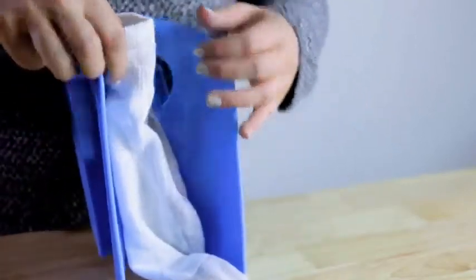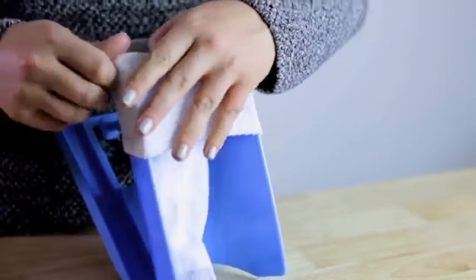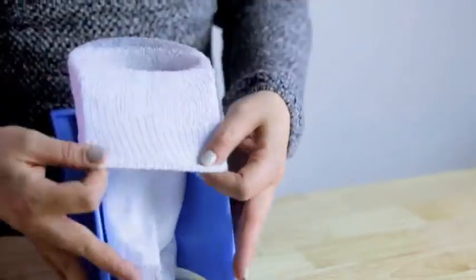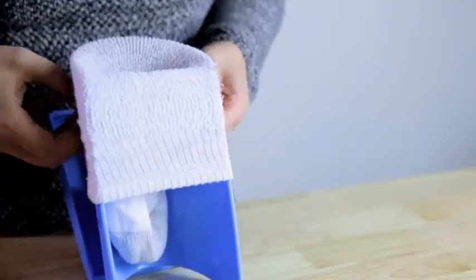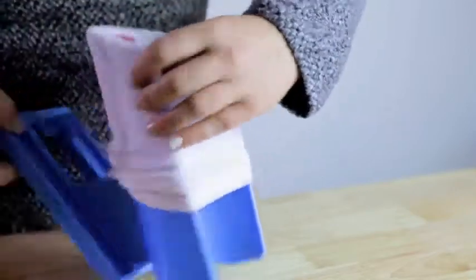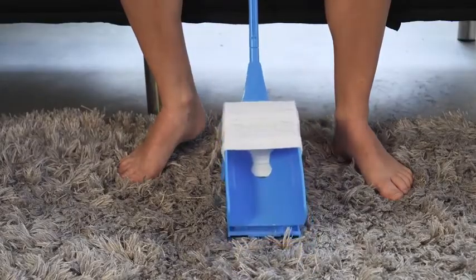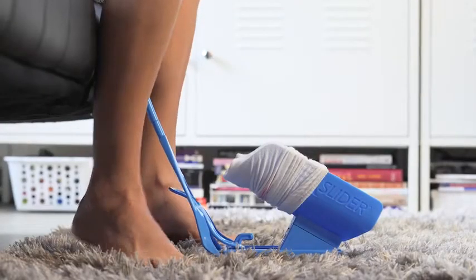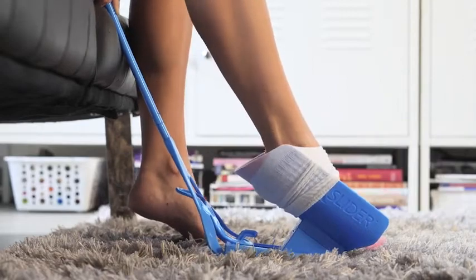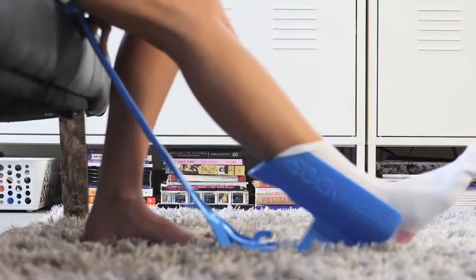To use the Sock Slider, place your sock heel side down in the Sock Slider system. Roll the cuff down the sides of the cradle until the toe is at the top. Use the handle to gently lower the Sock Slider system to the floor. Slowly ease your foot into the sock opening, sliding your heel to the bottom of the sock cradle until the sock is fully on your foot.